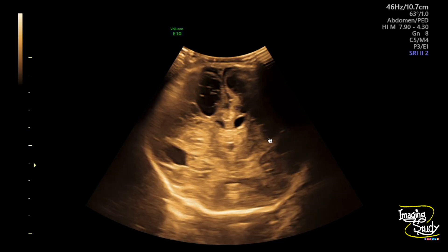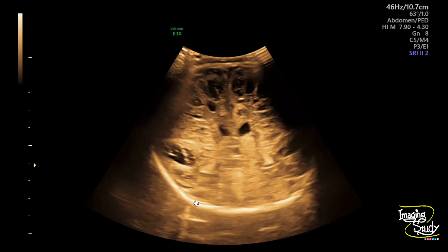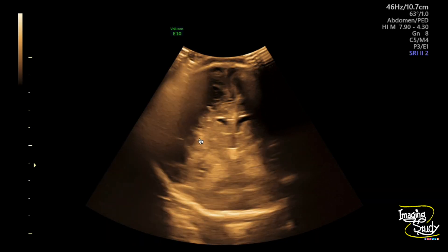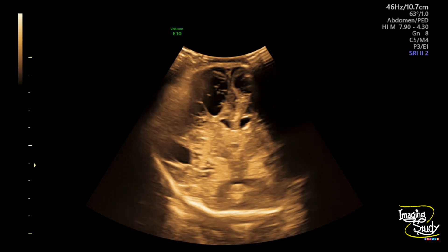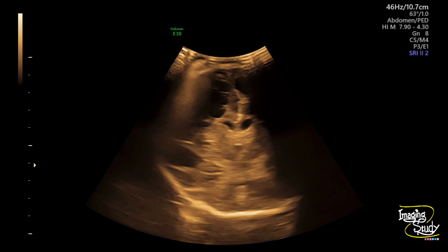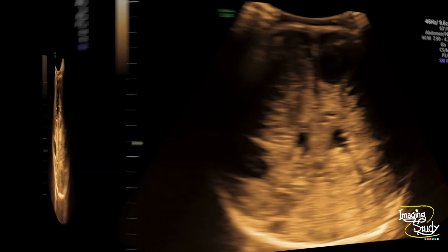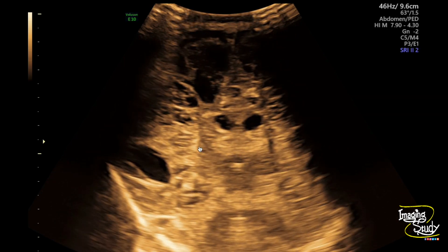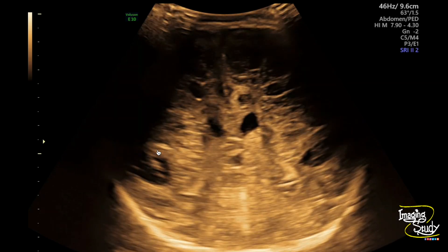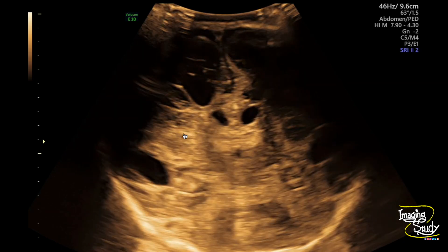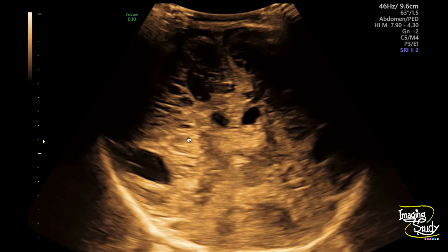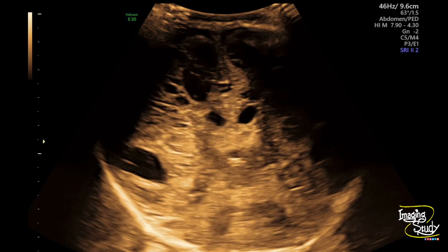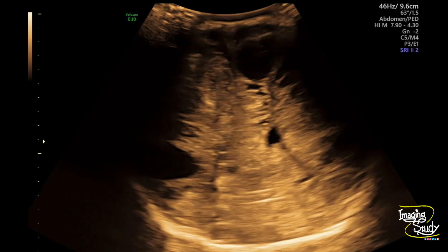Here on coronal section, you can see diffused cystic spaces throughout the cerebral hemispheres. If you look at the periventricular areas, these look quite echogenic. The ventricles are not dilated. Let's magnify a little. The cystic spaces are well visualized right now and you can see the periventricular increased echogenicity. The cystic spaces extend up to the deep white matter. This diffused cystic appearance of the cerebral hemisphere involving the deep white matter along with periventricular increased echogenicity is known as periventricular leukomalacia grade 4.